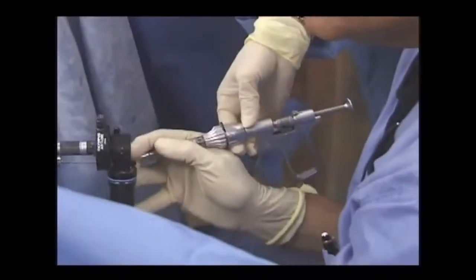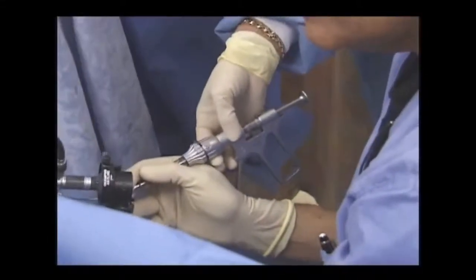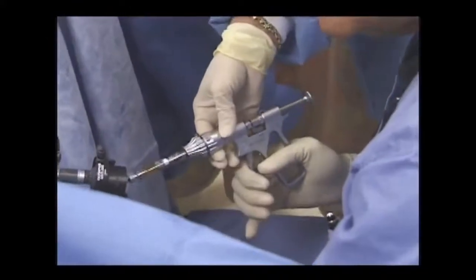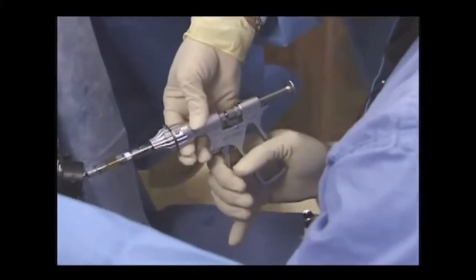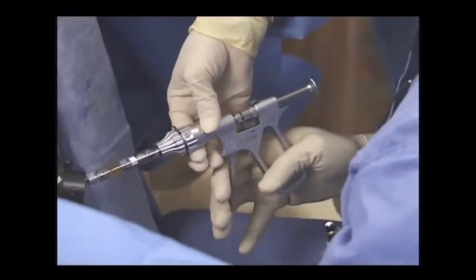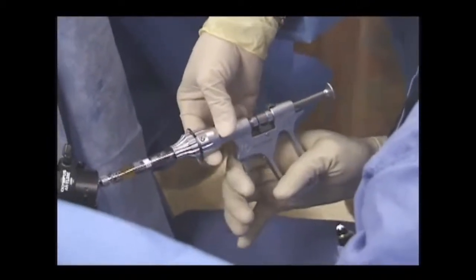It is important to implant the product slowly. Wait a few seconds between each pull of the administration device lever. It should take two or three minutes to inject the entire 2.5 milliliter syringe of macroplastique.